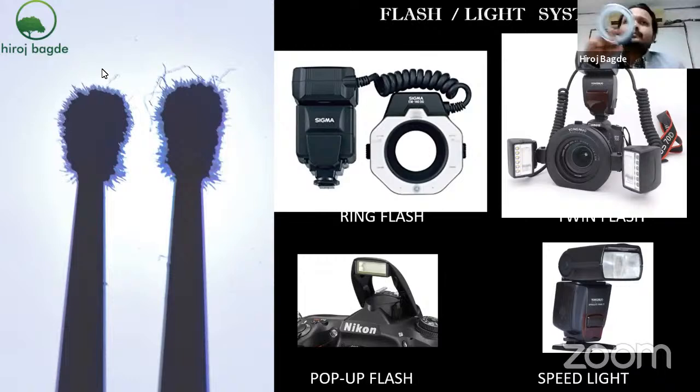See, all these parameters can never be utilized whenever you are having a point and shoot camera or a mobile. Mobiles nowadays have something called a selfie ring. Yes, I'm having it. Just clip it on to the mobile so that you get a circular kind of light. This is all white, which is the light. It has an LED inside. So once I switch it on, the whole ring will have lights inside it, and this can illuminate the area where I'm clicking.